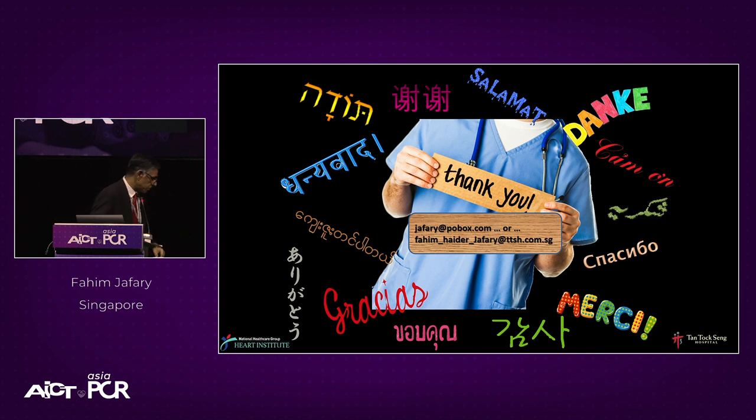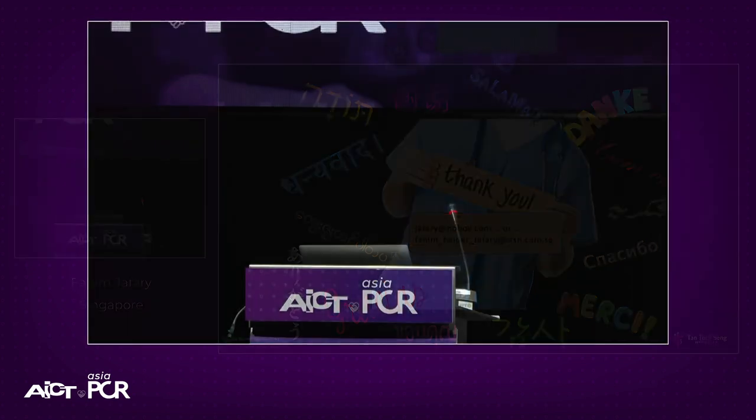Thanks, Fahim. Thanks for presenting the data. Actually, I was just in another session with Dijan. He mentioned that a few years ago, it was published in the SCAR registry, showing that in the small vessel subgroup, DES did perform better, although it's a non-randomized registry comparison. And that's just registry data. So I think we need more data before we say small vessel is better for DCB versus DES. I think it's still a toss-up in terms of a choice of therapy.